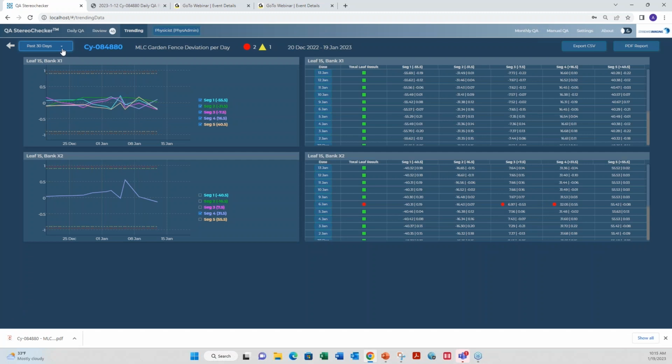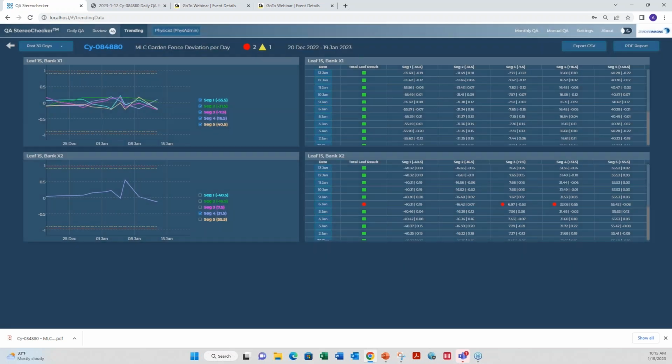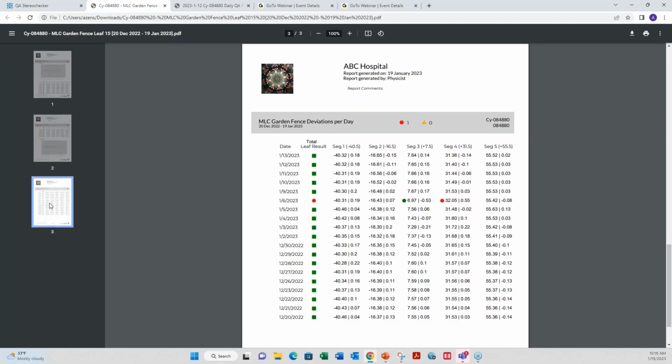Now notice the default is here for the past 30 days, but again, upgrade to the software. Not only are the reports better and nicely displayed with a table of contents, if you will, but you also have some date range selections here. The default, past 3 months, past year, or a custom date range where you select what you want. Comes in extremely handy if you've got an auditor or regulatory person in checking things and ask for a very specific report. You have it at your fingertips very quickly. You can see it created a download link here, and here we have that information about the individual leaves here.